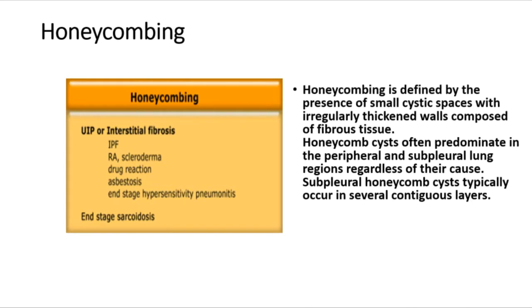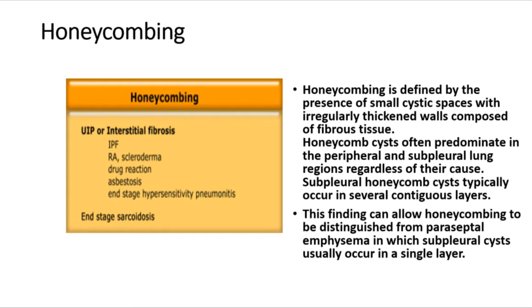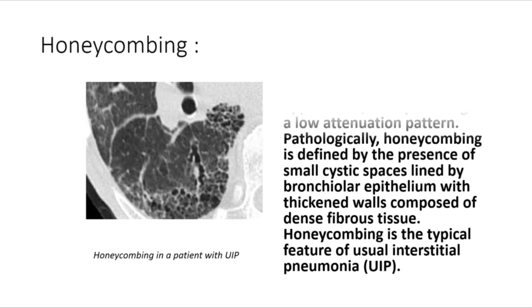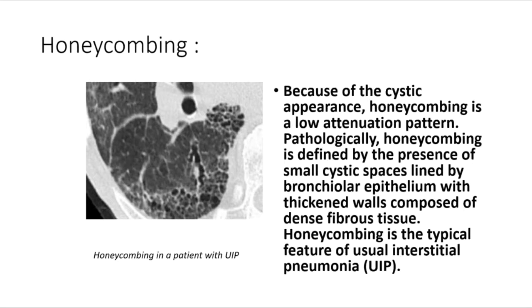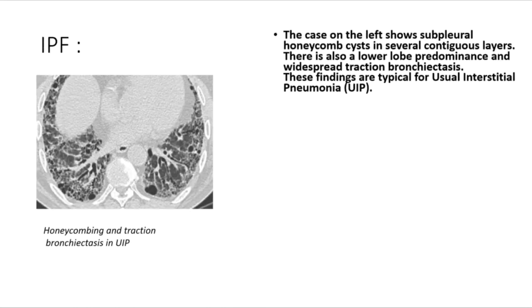Honeycombing is defined by the presence of small cystic spaces with irregularly thickened walls composed of fibrous tissue. Honeycomb cysts predominate in peripheral and subpleural lung regions and typically occur in several contiguous layers — distinguishing honeycombing from paraseptal emphysema, in which subpleural cysts usually occur in a single layer. Pathologically, honeycombing is lined by bronchiolar epithelium with thickened dense fibrous tissue walls. The case shown displays subpleural honeycomb cysts in several contiguous layers.